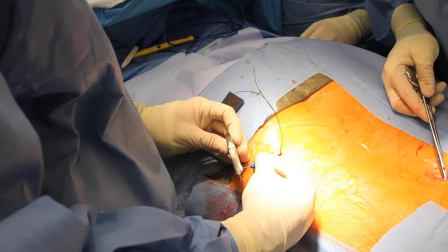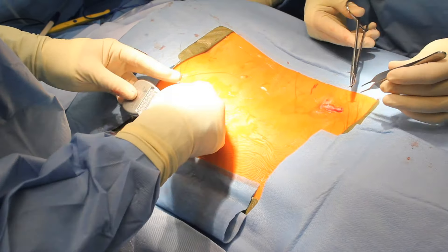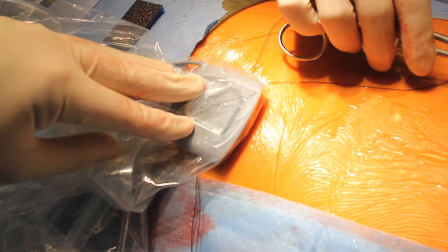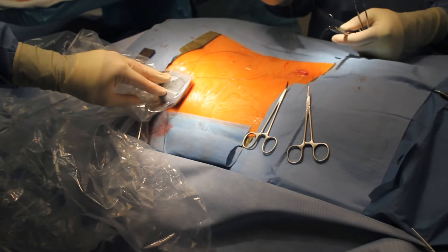The battery is anchored two centimeters under the skin, and using a sterile technique, the system is analyzed and programmed to ensure that it is in proper working order before the incisions are closed.